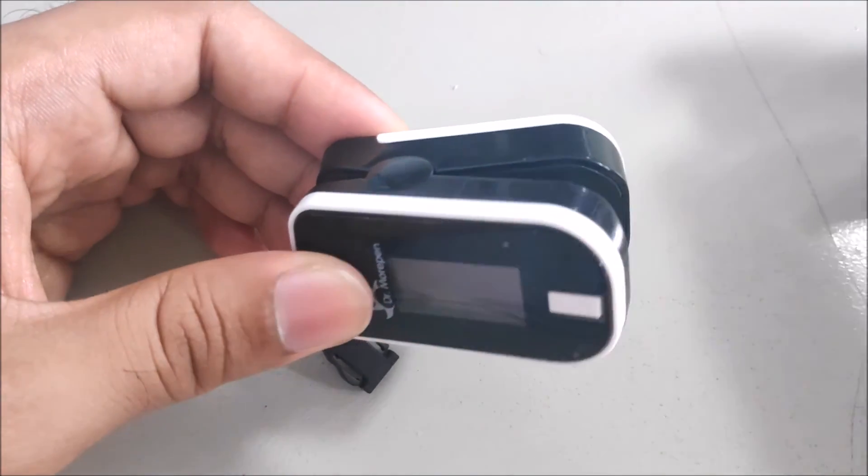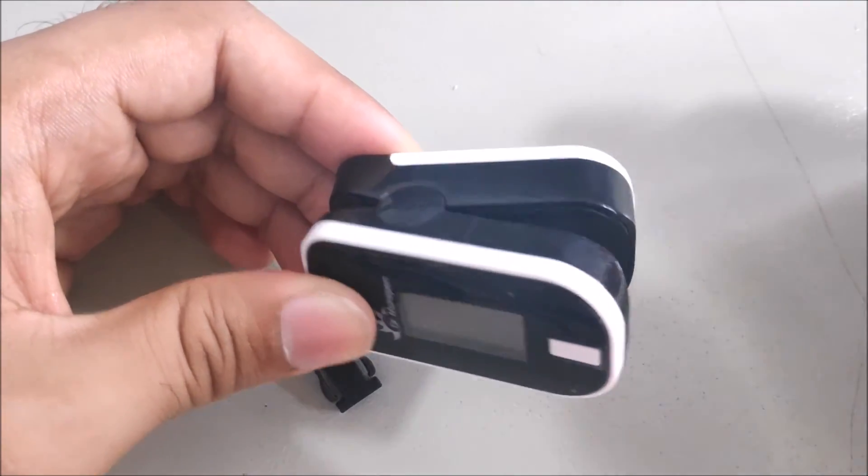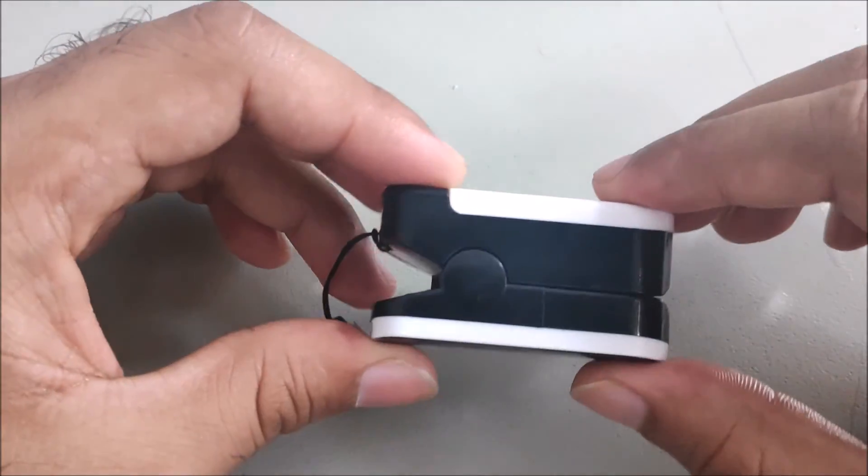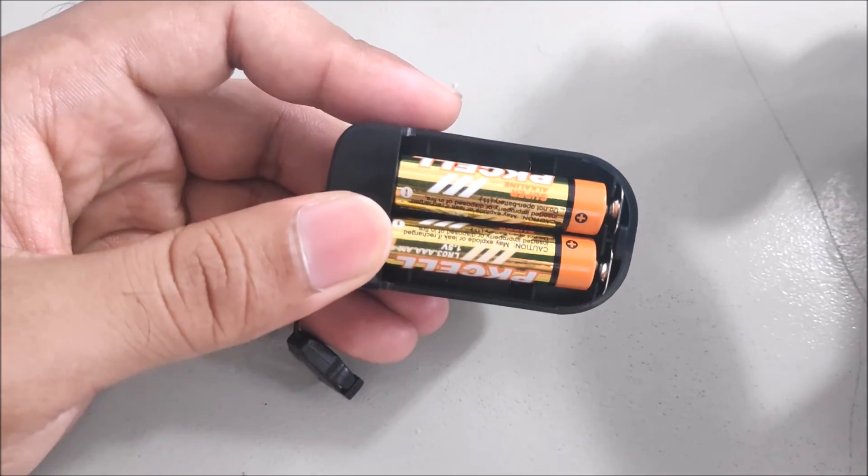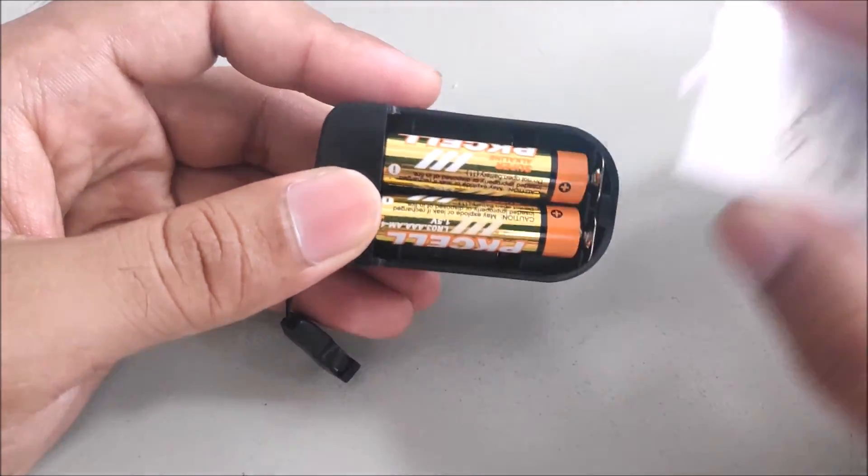This is the basic short video about the pulse oximeter. It uses triple A size two batteries.